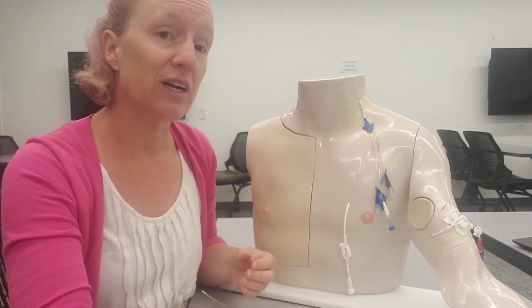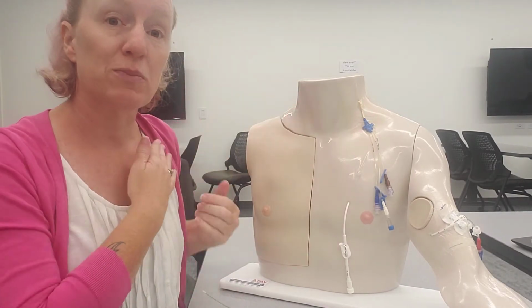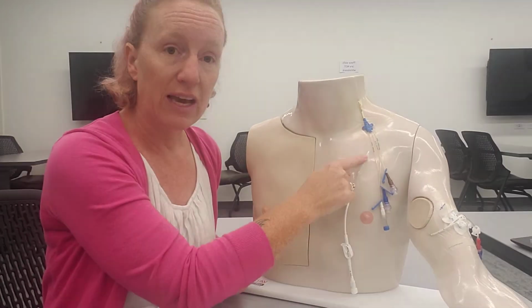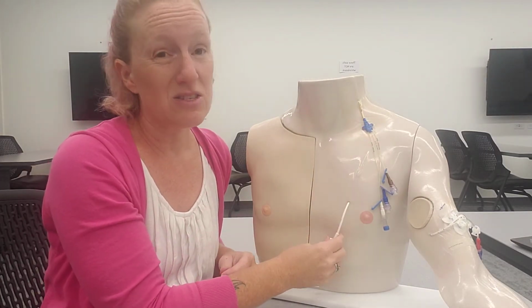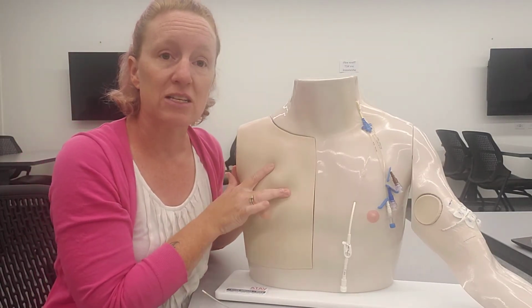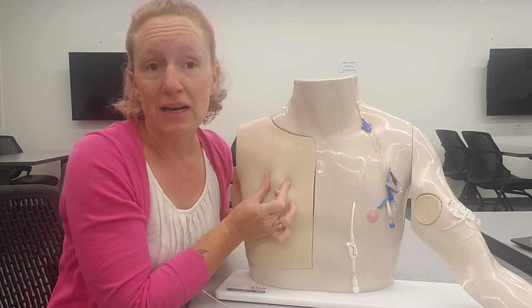Other types of central lines that we have, so we talked about the IJ. It can also be a subclavian, which means under the clavicle, subclavian. You've got a tunneled cath here. Those are usually for really long-term access. And then over here, you can't really see it, but this guy has a port, which is, again, another type of central line access device.